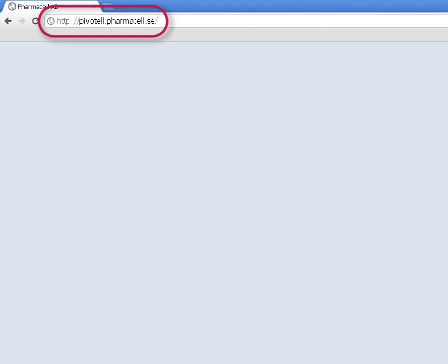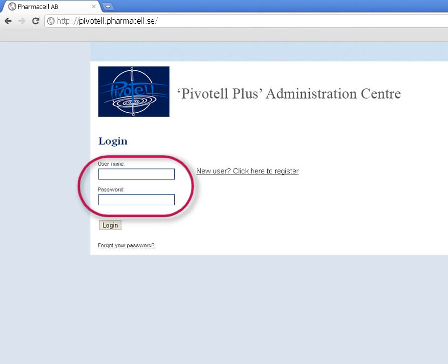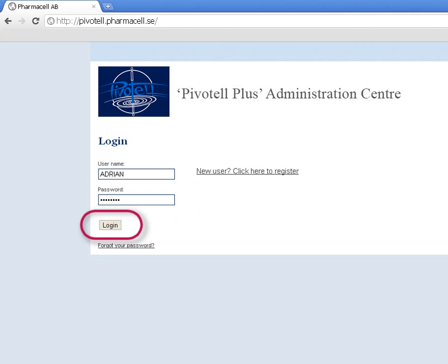To program the dispenser, log on to the Pivotel Administration Centre by typing the address shown here into your web browser. Next, enter the username and password supplied by Pivotel and click Login.